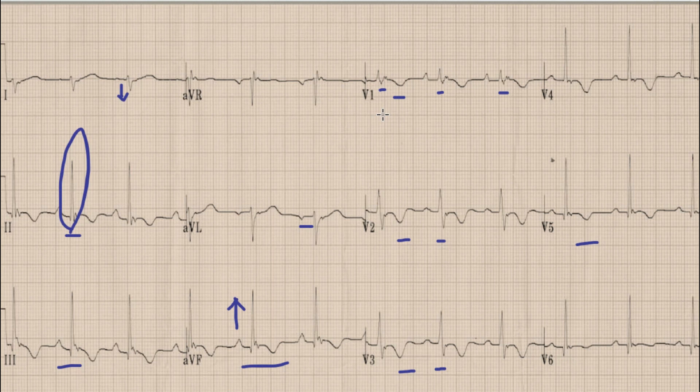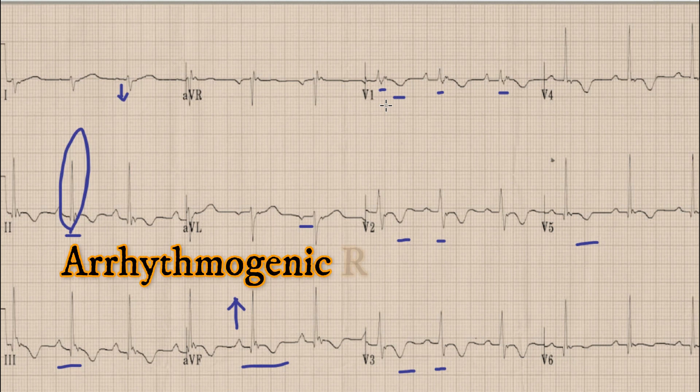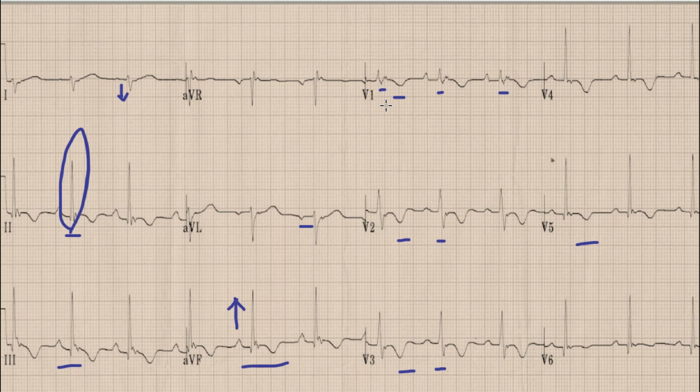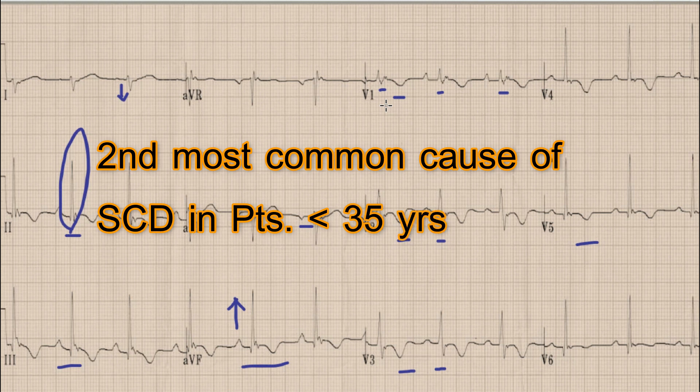So whenever you find right axis deviation, partial right bundle branch block as evidenced by a prominent R wave and broad QRS complexes, along with T wave inversions in anterior chest leads V1, V2, and V3, plus a hump after the QRS complex in V1, V2, and V3 — the diagnosis is Arrhythmogenic Right Ventricular Cardiomyopathy, also known as ARVC. ARVC is the second most common cause of sudden cardiac death in patients less than 35 years of age.